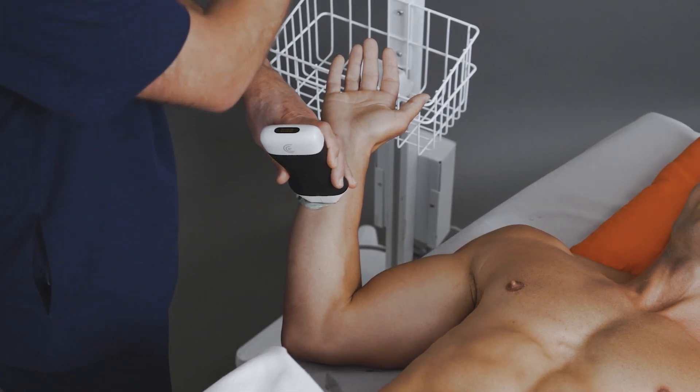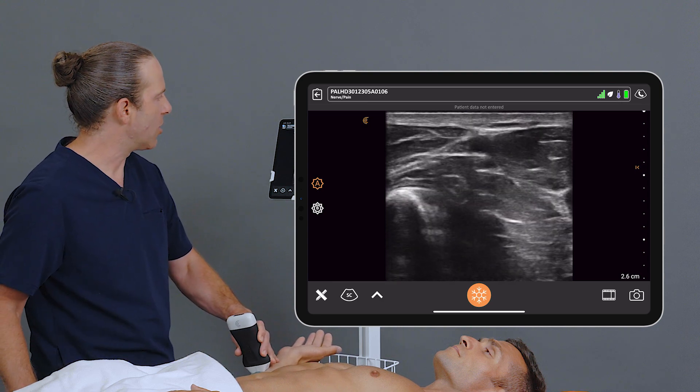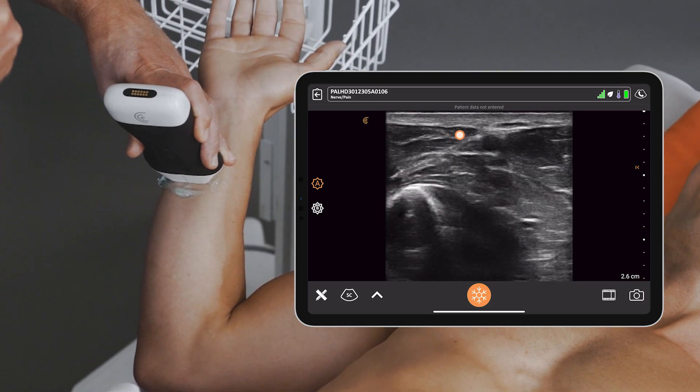I'm going to put the scanner down in transverse orientation. The target to find is the ulnar artery. Once I've identified the ulnar artery, the ulnar nerve is ulnar of the ulnar artery.